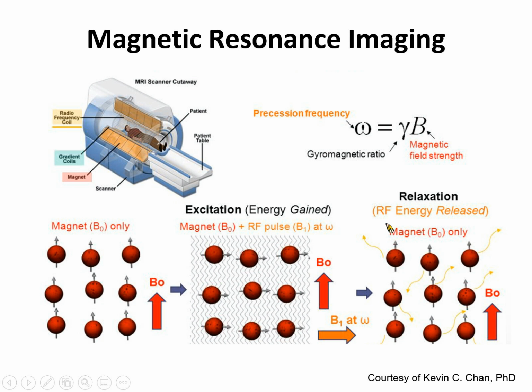This release results in an energy release. So you can immediately picture that different atoms and different particles will release different radio frequency energy.